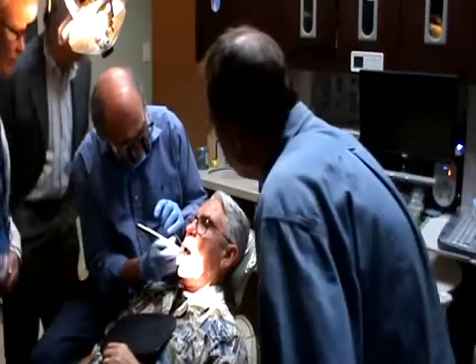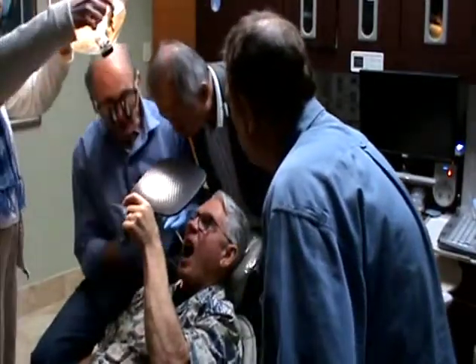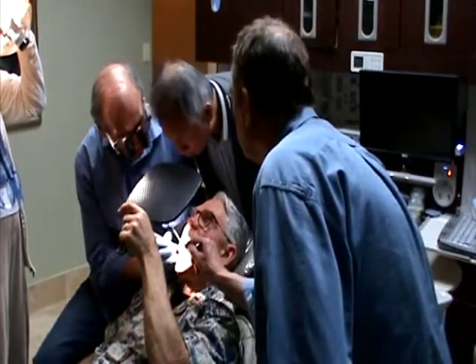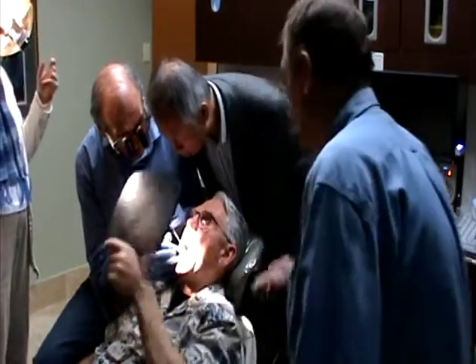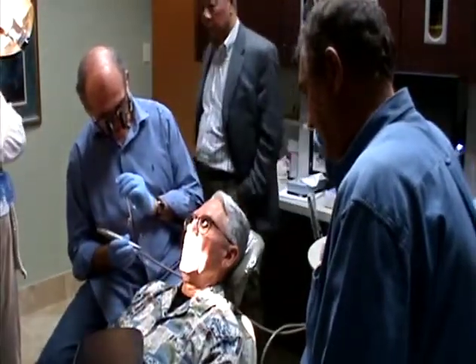If you hold your mirror, it looks like it's off of that and now it's low. I'd leave that one, be the one that's on the lingual cusp, or the lingual.